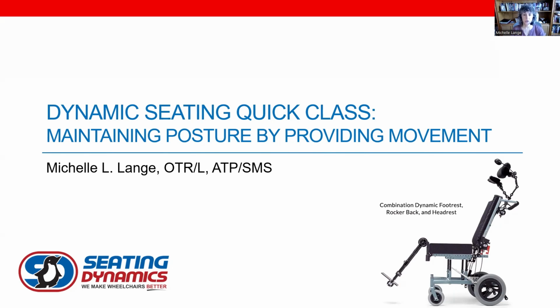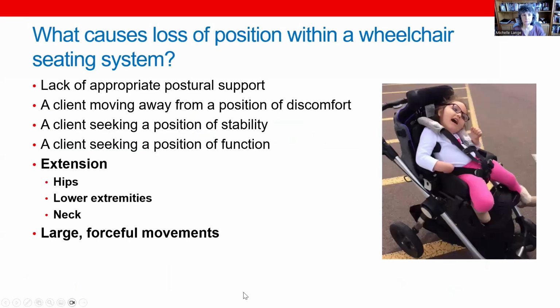Today we're going to take a quick look at maintaining posture by providing movement for the client. So what causes a loss of position within the wheelchair seating system? Well, lots of contributing factors could be responsible.